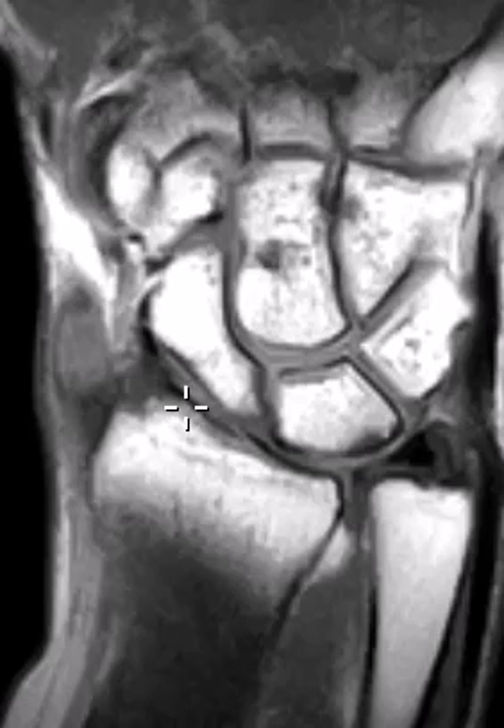On this side we notice the distal radius articular surfaces and the distal ulna are at about the same level. Normally the ulna will be a little bit shorter because there needs to be room for the triangular fibrocartilage. So this is a little bit too long — a really mild positive ulnar variance. If it's back a little we call it neutral variance; if it's really low we call it negative variance; if it's a little too far we call it positive.